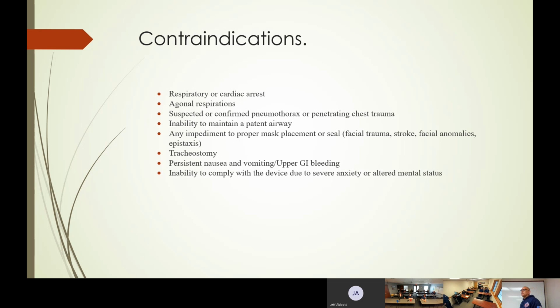And first of all, what would you ask them about CPAP? Have you ever had it before? Yeah, have you ever had a CPAP treatment before? There's a chance they live on one or whatever, so it may be nothing to them, right? Maybe we're in an out of home environment. They have an onset of the difficulty breathing at the store or something, but normally, yeah, I get CPAP all the time. But anyway, say, here's what I need to do.